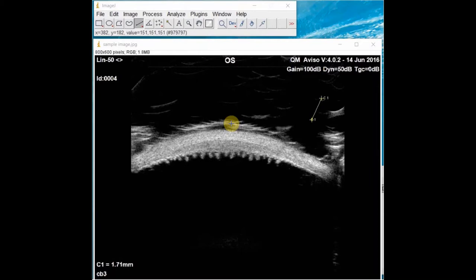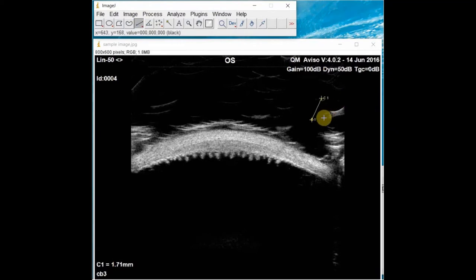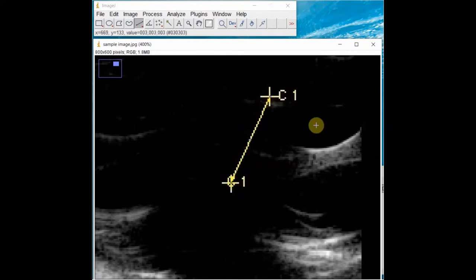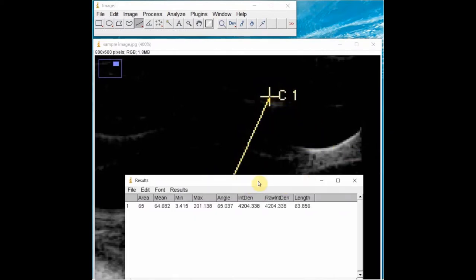Before measuring the parameters, we will first need to set the scale. To do this, use the straight line tool and trace a line over the C1 line from crosshair to crosshair. You can zoom in to make visualization easier. Once the line is drawn, hit Ctrl-M to measure the length of this line. Record this number as your reference number — in this case, it is 63.856.